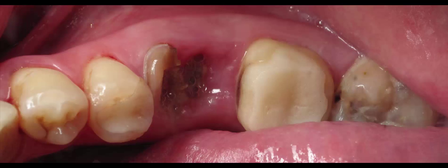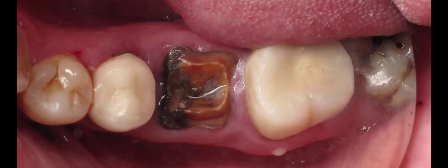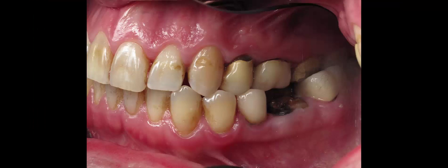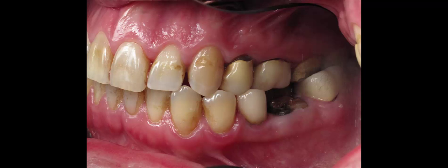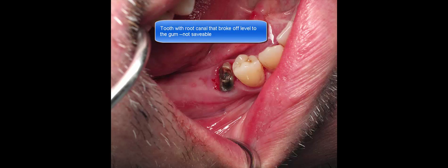These teeth are going to end up being extracted with socket bone preservation grafts done simultaneously under IV sedation with a combination of LPRF, cow bone, and human bone. And you'll see that before the teeth are extracted that we actually lost tooth number 29. It broke off. Here's the other teeth extracted.